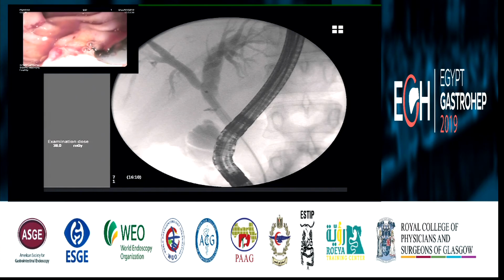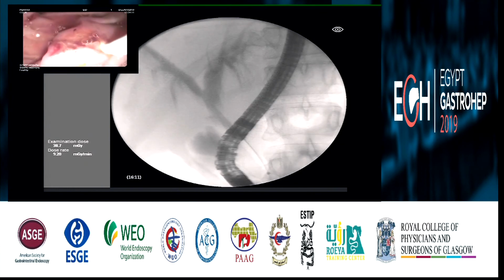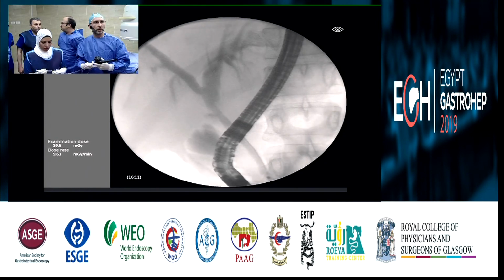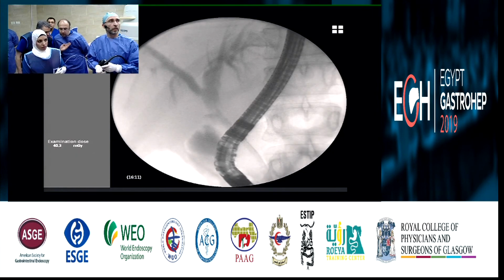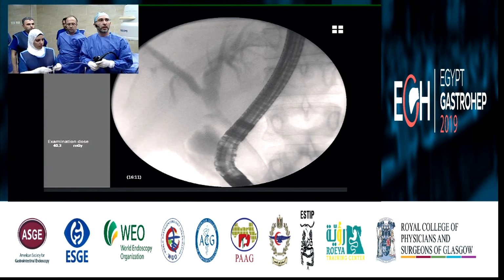Ivo. Yes? Tell me. Yeah, we're listening. You can deflate. If we decided to put two stents in the CBD, which side do you prefer to insert first, right duct or left duct? What was the question? If we will insert two stents, right and left, which will we start first, right or left?